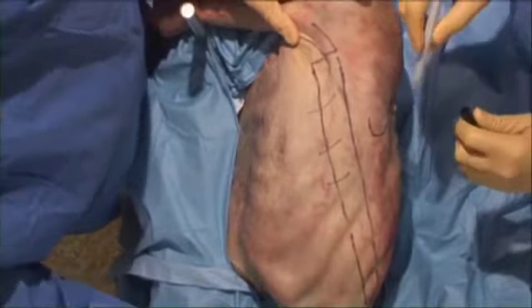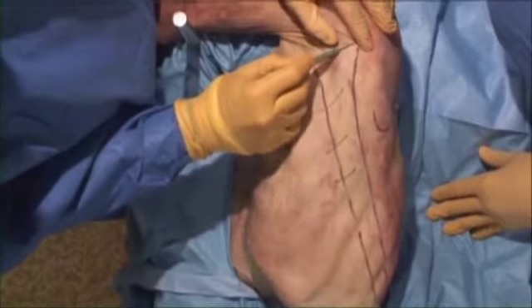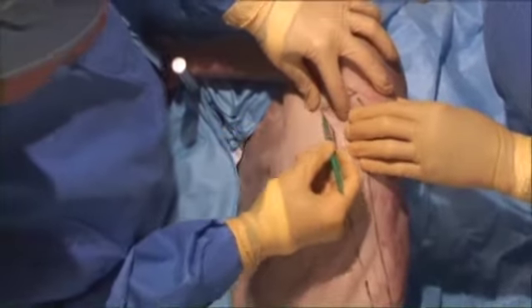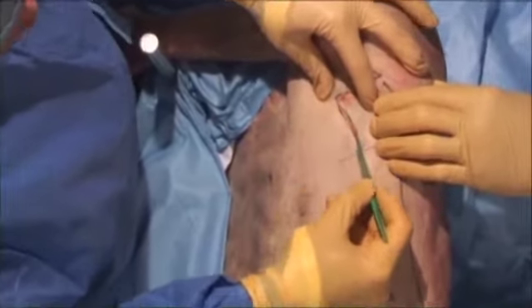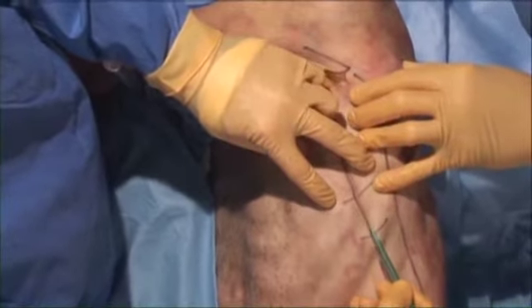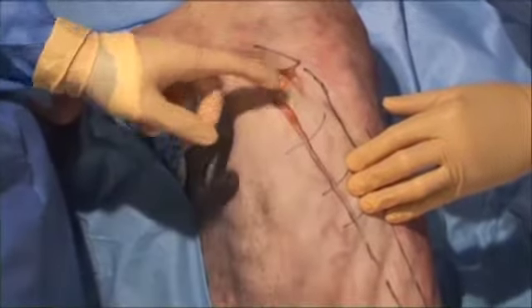Can I have a scalpel? Thank you. So through the skin, all the way down, and this incision is going to be very generous, but it's important to recognize that you can use any segment of this incision along there without using the whole incision.